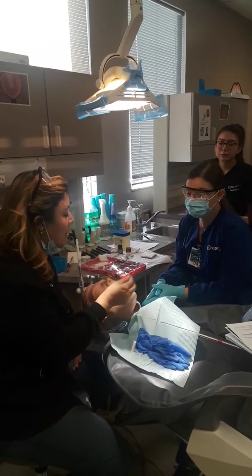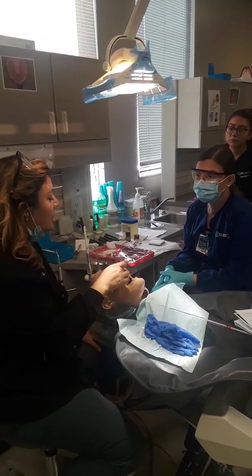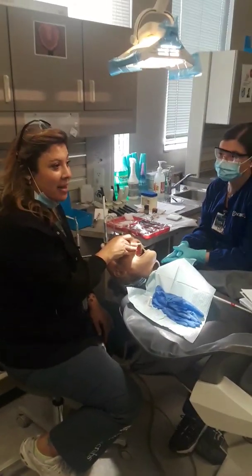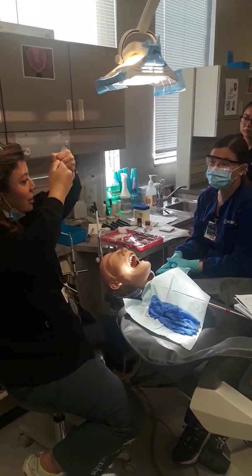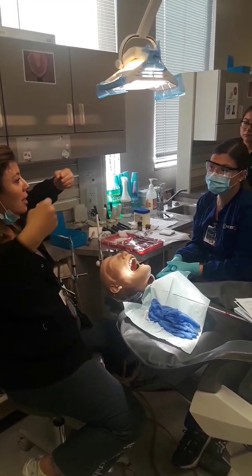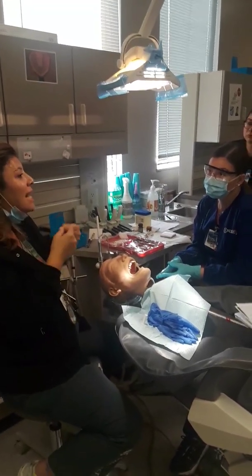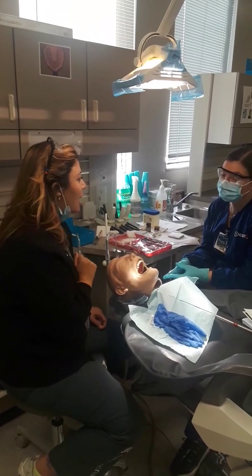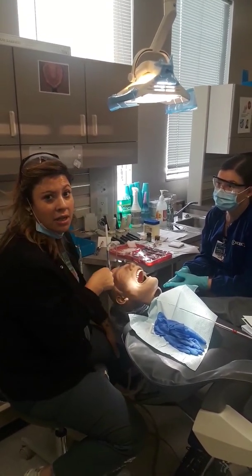If this crown is ever removed, they have to come back, because if they walk around with the nub, we're gonna call it a nub, the teeth on the adjacent side will start moving in. So now when we did our final impression to it being out, the teeth moved in. Now this crown will never fit. So it protects the space, protects the tooth, and also gives aesthetics, especially for the front. Okay? So they have to have this on for 2 weeks.